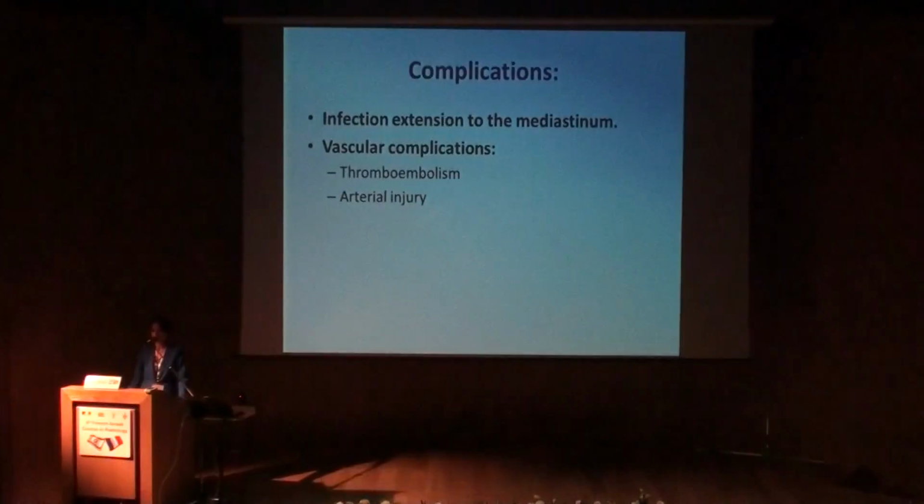We can get some complications from the deep neck infections, either infection and extension to the mediastinum, and vascular complications such as thromboembolism and arterial injury.